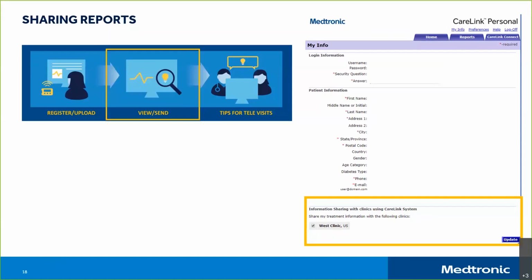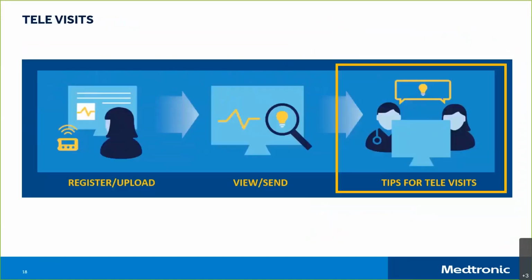Thanks, Rhonda. That's really helpful. Let's talk about televisits. I recently started doing my 3-month regular checkup with my provider through telehealth. My provider is able to see my reports, and like I said, I always try to upload my data at least a day prior so that everything is ready for her to review. I didn't know my healthcare provider had the ability to see my reports remotely until one day I asked the question and discovered that this was an option. Rhonda, what are some things you recommend that I should ask during my telehealth visit?